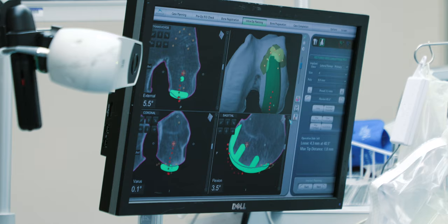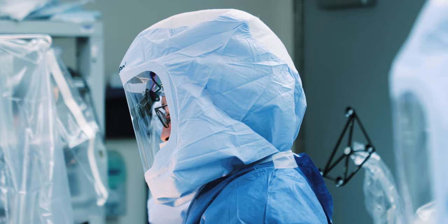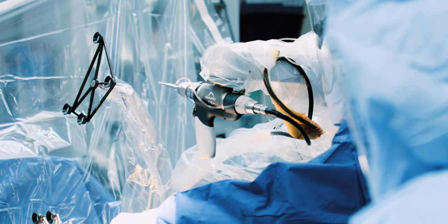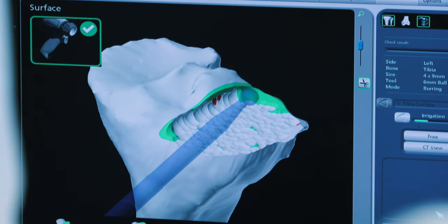I tap the corresponding points on the patient that match specific points on the 3D model in the robot's brain. After tapping 20 to 30 points, the robot knows exactly where your knee and its structure are in space, so it can guide me and help make those cuts more precisely.